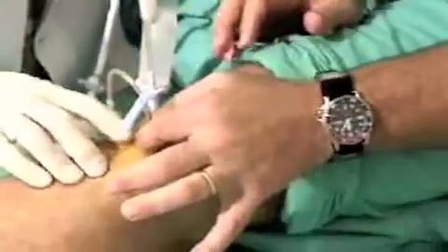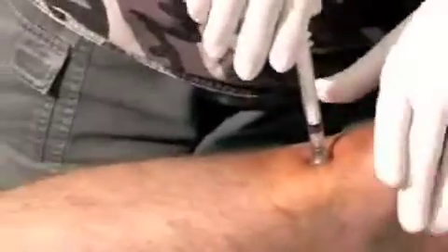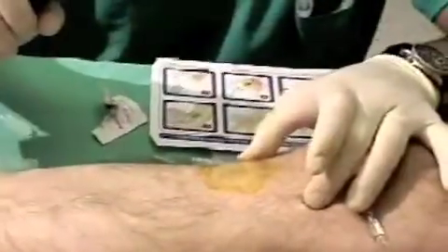15 per 6 seconds times 10 is a minute, so that's 150 per minute. Yeah, it's totally zero. It's totally flat. It's good and stable. I feel absolutely nothing around it. Okay, we're going to use a technique of holding the leg, pulling gently upward while we twist clockwise. I felt nothing. Not a damn thing. You see, people are worried about how bad it's going to leak and bleed after you take it out. Not. IVs do worse than that. Oh, yeah. 15 gauge IV, can you imagine? It would be pouring out. You ready? I'm ready. Here we go.